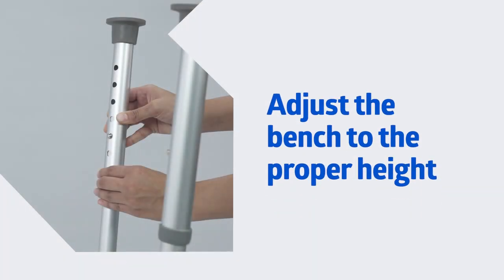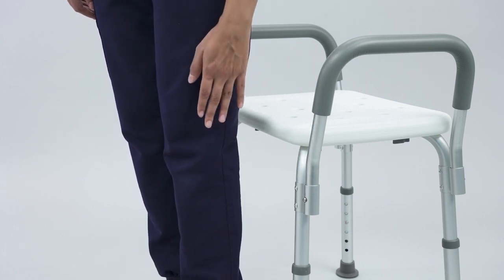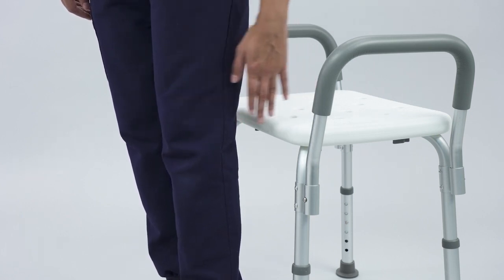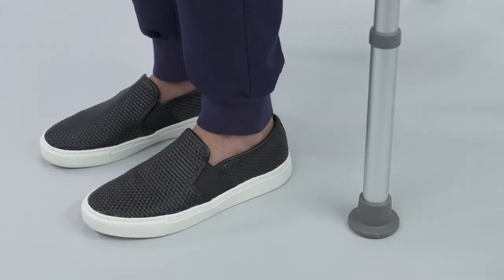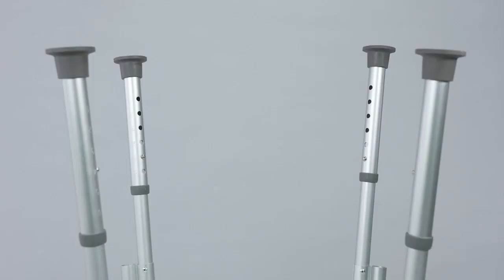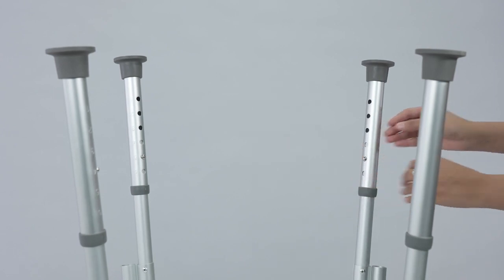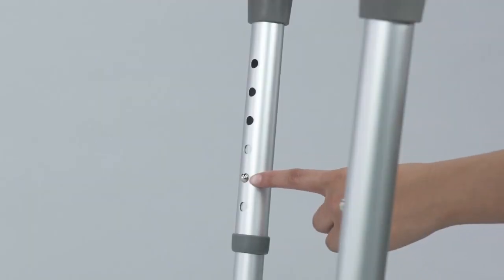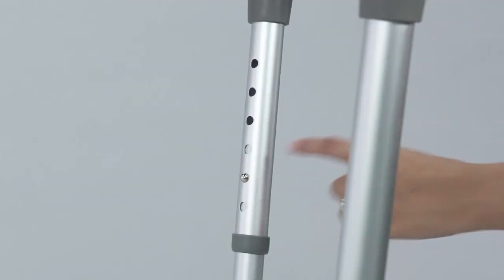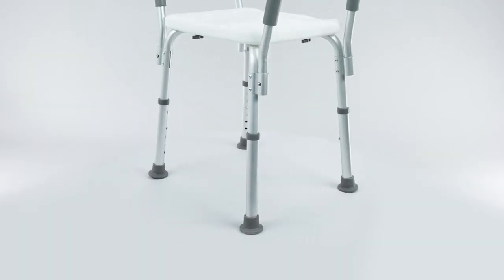This segment is going to show you how to adjust the bench to the proper height. While standing in front of the assembled bench as if preparing to sit, the back of the user's knees should touch the seat bench. This should allow the user's feet to be firmly on the floor while properly seated. Adjust the leg extensions as needed by depressing the push buttons. Check that the push button protrudes fully and that all leg extensions are adjusted to the same height. Ensure that all four tips rest evenly on the floor.